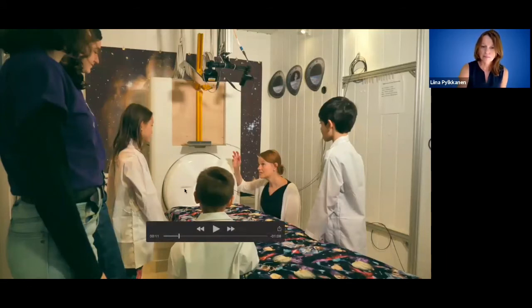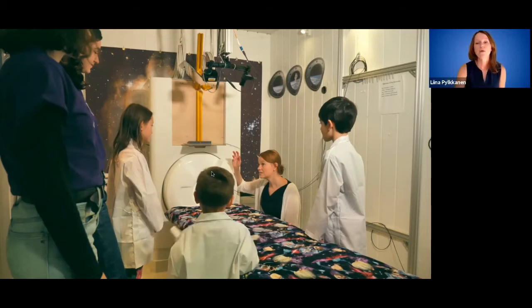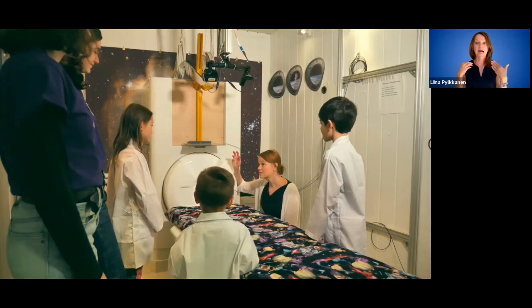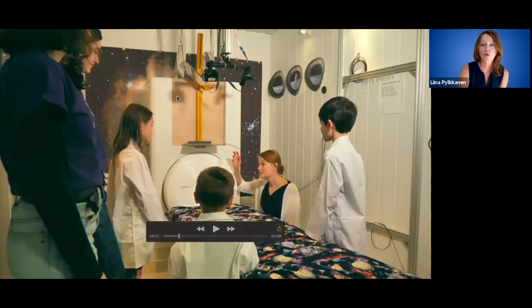And so now the MEG sensors are here pretty close to the head, so they're really picking up the brain activity. But then we also place channels kind of out here, far enough from the head so that you're not capturing any of the brain activity, but you are recording all of the urban noise, or the environmental noise. So everything that kind of doesn't come from the head. And then in the data analysis, we remove from the data anything that correlates with the recording that we took of the environmental noise.